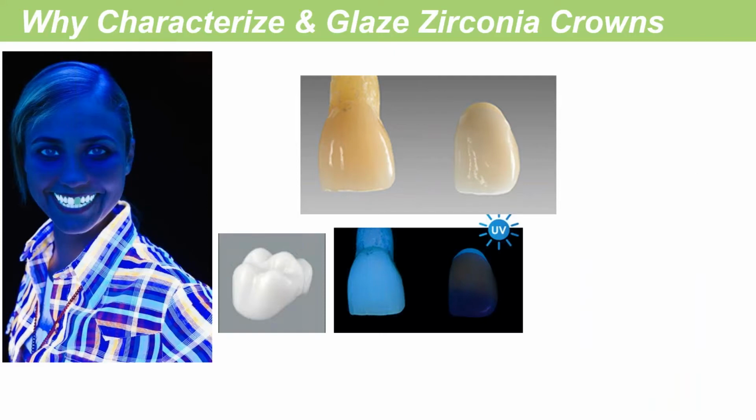And so the black hole effect, what are we talking about? If you guys have ever worked with zirconia, you know some of the issues that are related to it. One of the big ones that we're going to talk about today is fluorescence: zirconia has no natural fluorescence. And I don't go to the discotheque like I used to back in the day, but every so often you would see like this poor girl on the side there, you know, nice brilliance, fluorescence, and then one dead looking tooth. And that is something we want to try and avoid.